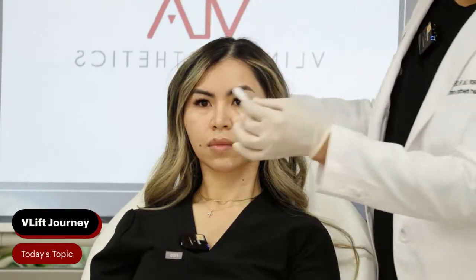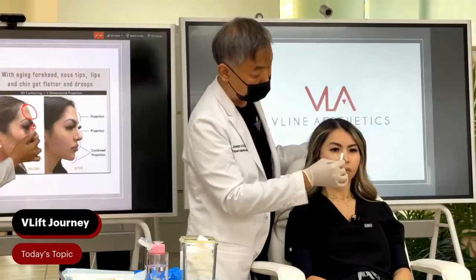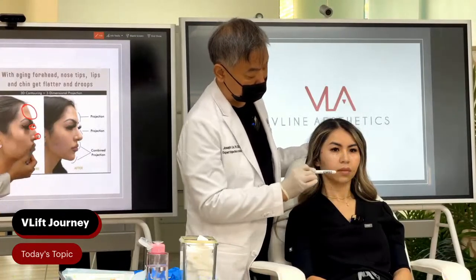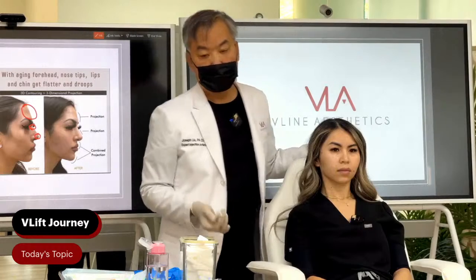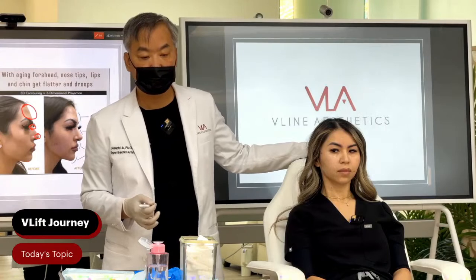Okay. So the third part of looking at the face as a whole is called 3D contour. Helen, as we age, what happens to the middle of the face? We start to get flat and droopy. Okay. And what's the solution? Tell us about 3D contour. We use fillers to project the areas that are flat, and oftentimes you see a couple areas that get flat, and that's the forehead region, the tip of the nose, and the bridge. Also, the lip and chin start to get flat, and so we project it using fillers or PDO threads, so it is a combination therapy.